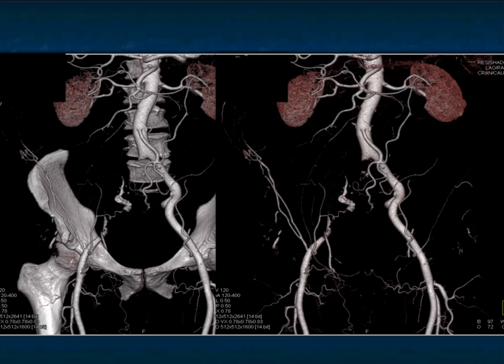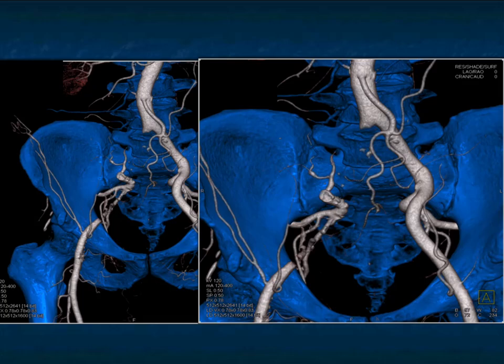The patient ended up having this thrombus be removed or trying to remove it, and the path came back that it was a sarcoma. So I like to end with this case just to make the point that vessels are always challenging. We talk about vasculitis, we talk about aneurysms, we talk about dissections, we talk about all sorts of processes. We talk about complications when we do repair, when we don't do repair.